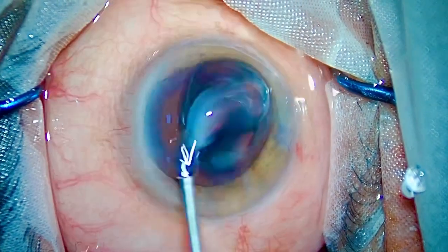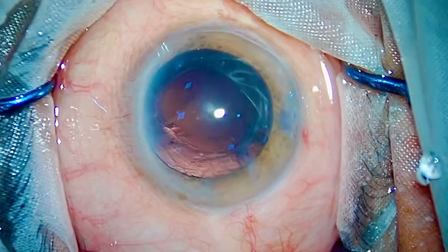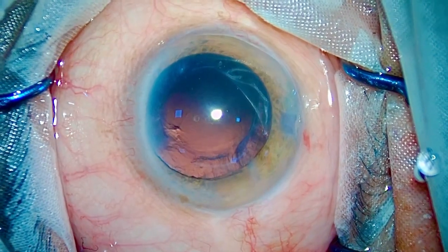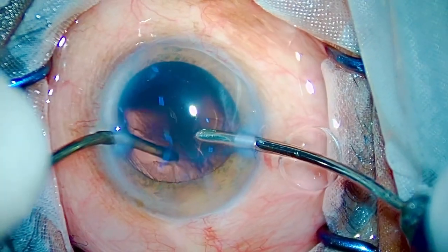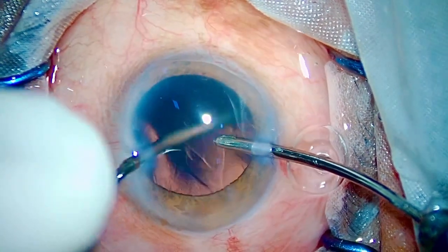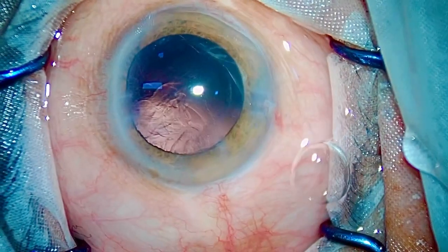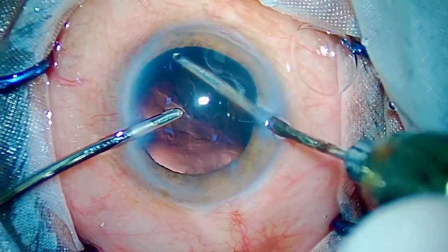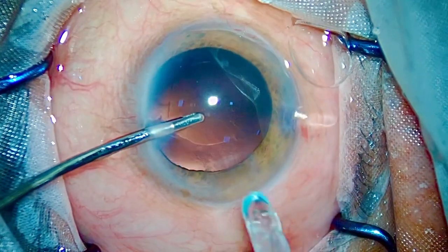The cataract is gone — the hardest part is over. I'll aspirate the cortex and implant the IOL. Three key takeaway points: first, always keep the anterior chamber deep with adequate Visco; second, never ever do hydrodissection in white cataracts; and third, hold the nucleus with its belly, and at the end use a dialer instead of a chopper for those last remaining pieces during quadrant removal. That's all from my side — I hope you liked the video, thank you so much.